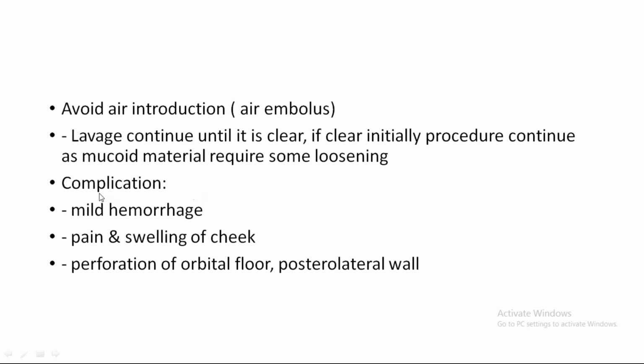Complications: the most common complication, not written here, is a vasovagal attack. A patient may collapse, and you may have mild hemorrhage. Pain and swelling of the cheek occurs only when you have a false passage. Instead of entering the maxillary sinus, the trocar is in the muscular soft tissue of the cheek, and if you push the saline, swelling develops immediately and it is very painful. Perforation of the orbital floor or posterolateral wall can also occur.